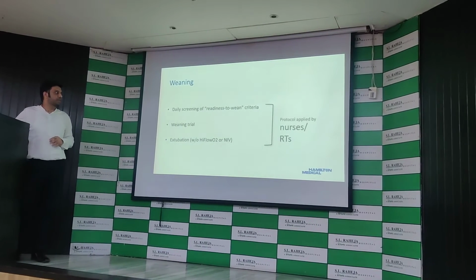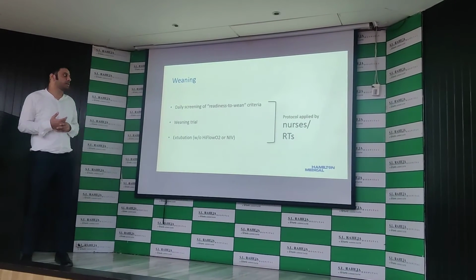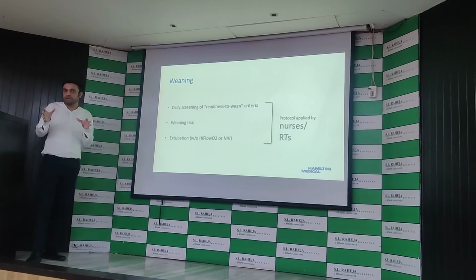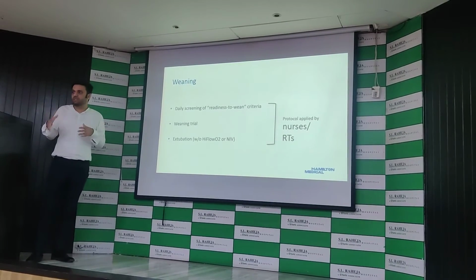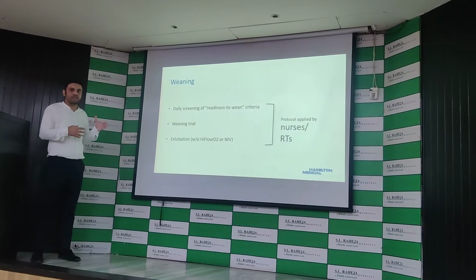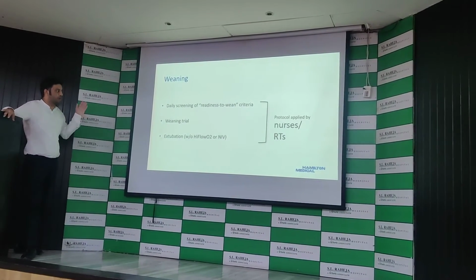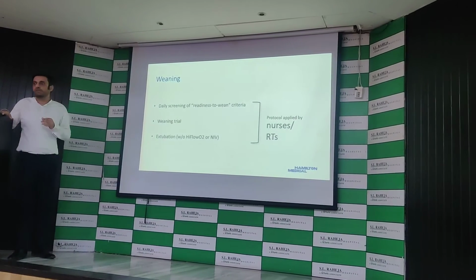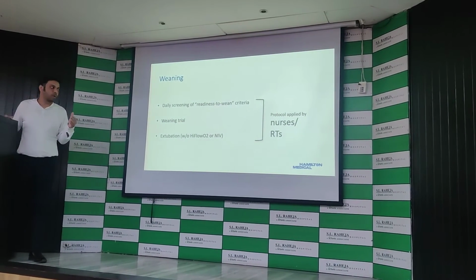Now weaning. When it comes to weaning, we of course have to see the screening and criteria for weaning, and we need to see how ready the patient is to be taken off the ventilation. All other hemodynamic parameters we of course have to observe, as we anyway do for patients: blood pressure and other things, fever, and secretions. All that comes in addition, but when it comes to the respiratory part, you will see the spontaneous activity and you will be able to reduce support. So again, daily screening is something we have to do. Then the weaning trial, which includes our SBT, which can be done in the machine, and then extubation to either high flow or NIV.